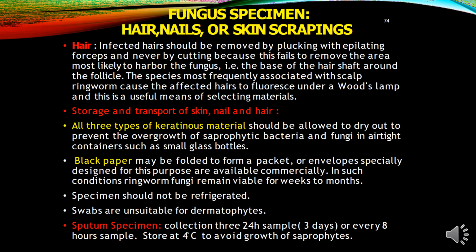Storage and transport of these can be done by using the black paper method, and all these types of material should be allowed to dry out, preventing the overgrowth of saprophytic bacteria and fungi, in airtight containers such as small glass bottles. Specimens should not be refrigerated. Swabs are unsuitable for dermatophytes.